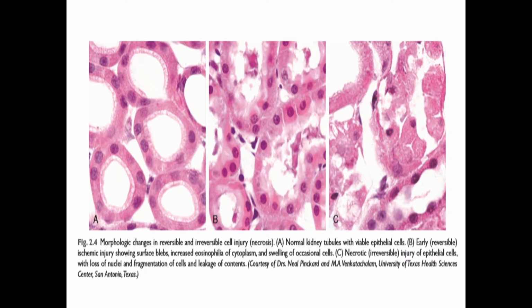C, necrotic. We reached the stage of necrosis, which is irreversible injury of epithelial cells, with loss of the nuclei, some of the nuclei lost from the cell, and fragmentation of the cell and leakage of its content.